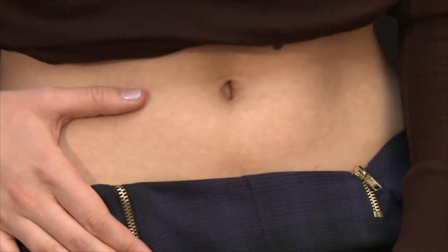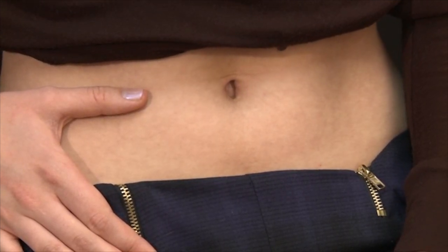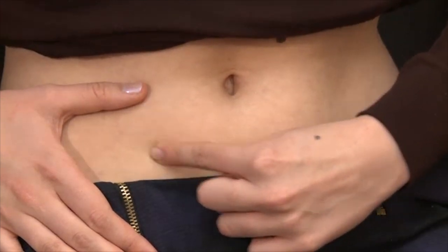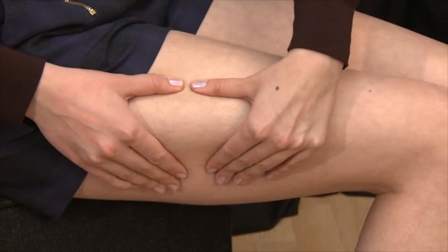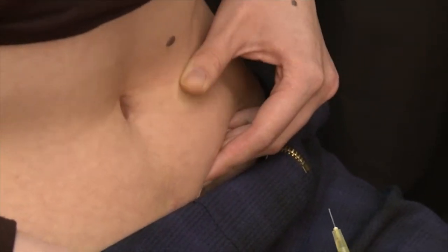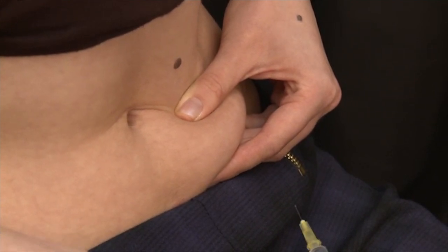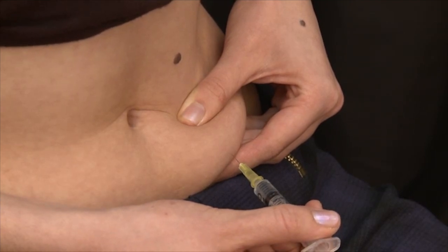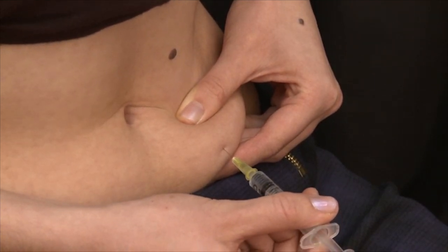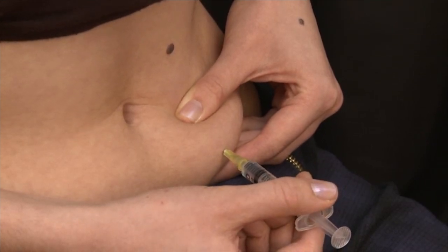You are now ready to give the injection, which must be done immediately. Your specialist or nurse may have advised you on a suitable site for injection. Good areas to perform a subcutaneous injection are the tummy or the front of the thigh. At your chosen site of injection, pinch the skin together firmly and insert the needle at an angle of between 45 degrees and 90 degrees, injecting under the skin, taking as much time as needed to inject all the liquid. Do not inject into a vein.